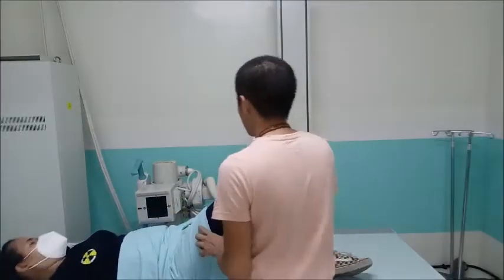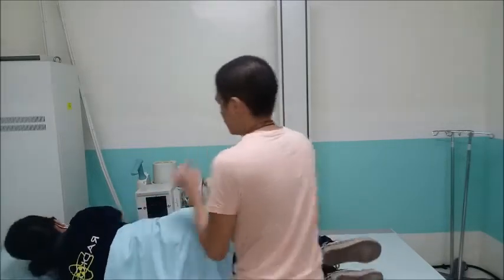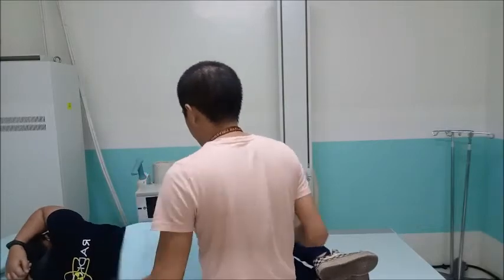Ma'am, you are exposed over there. Oh, okay. Yes, of course, you need to provide privacy.